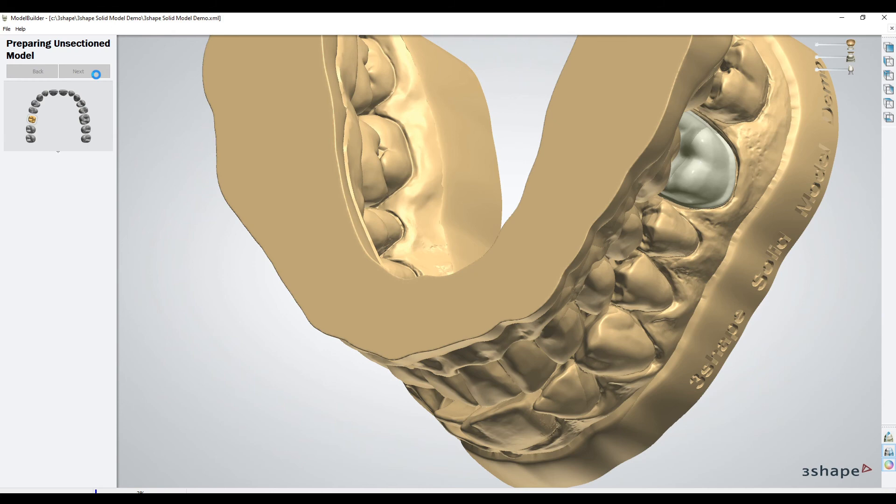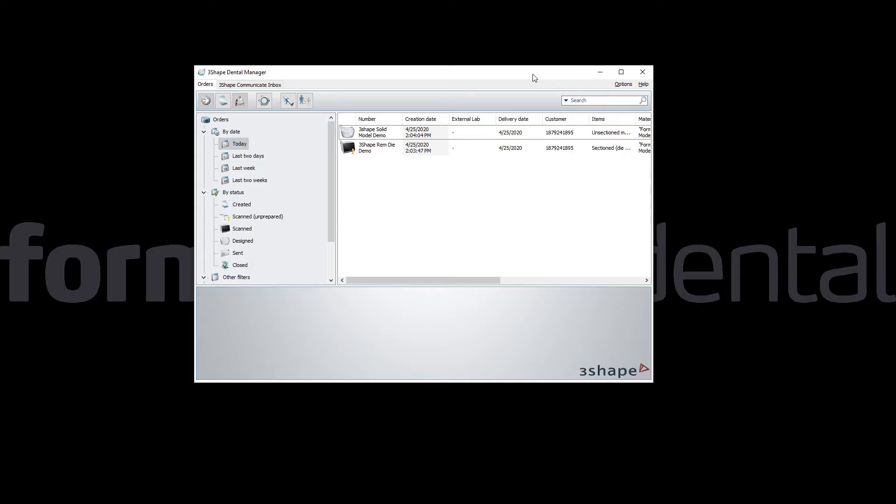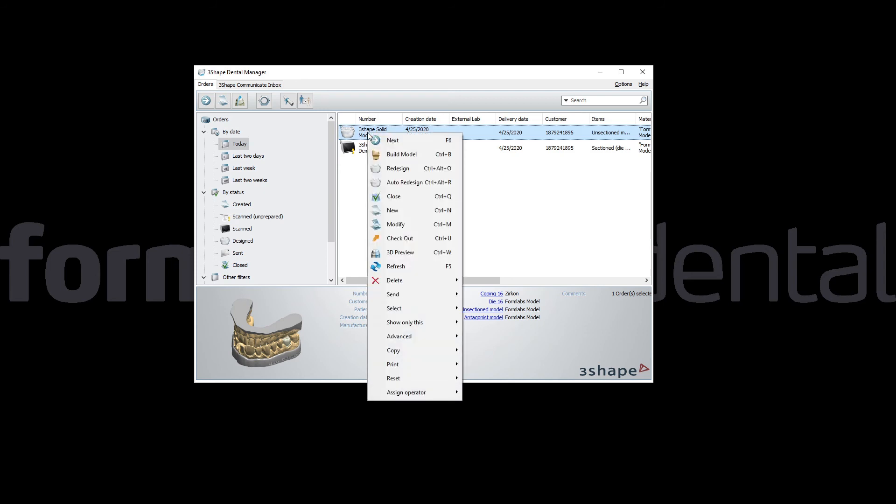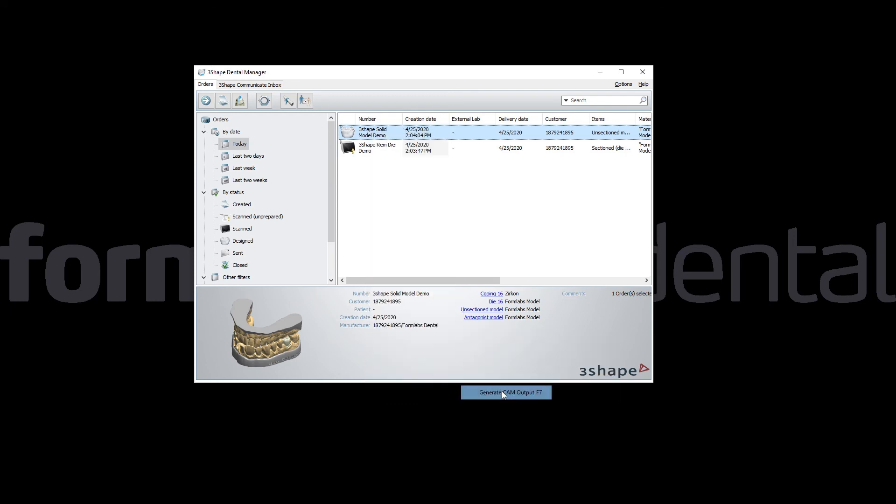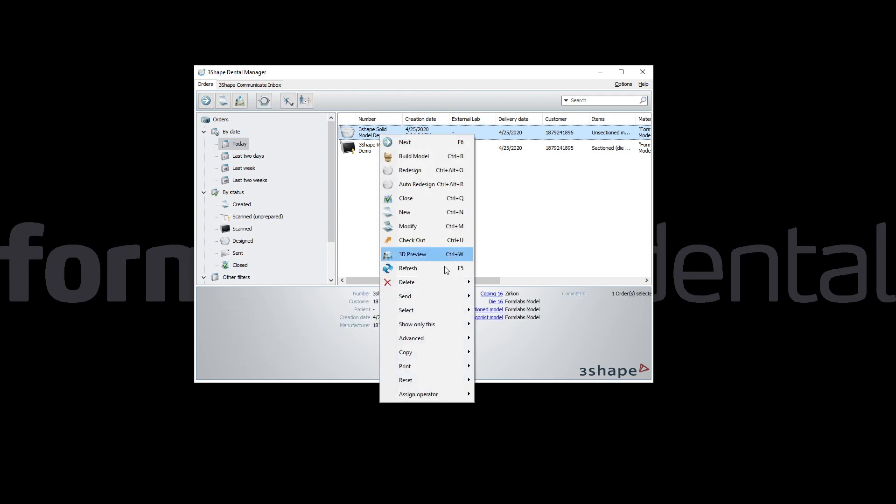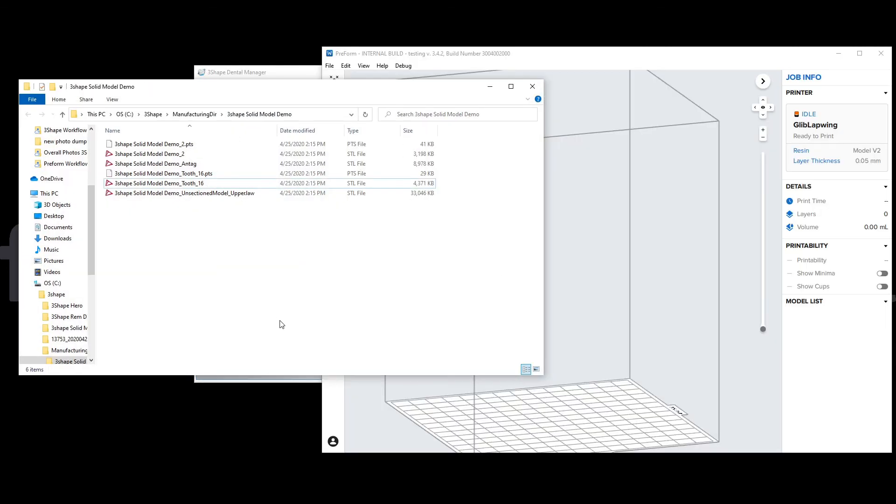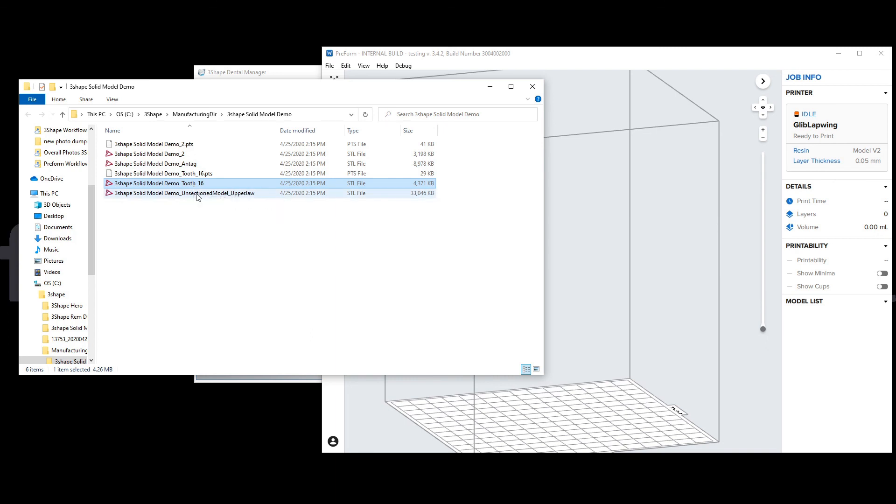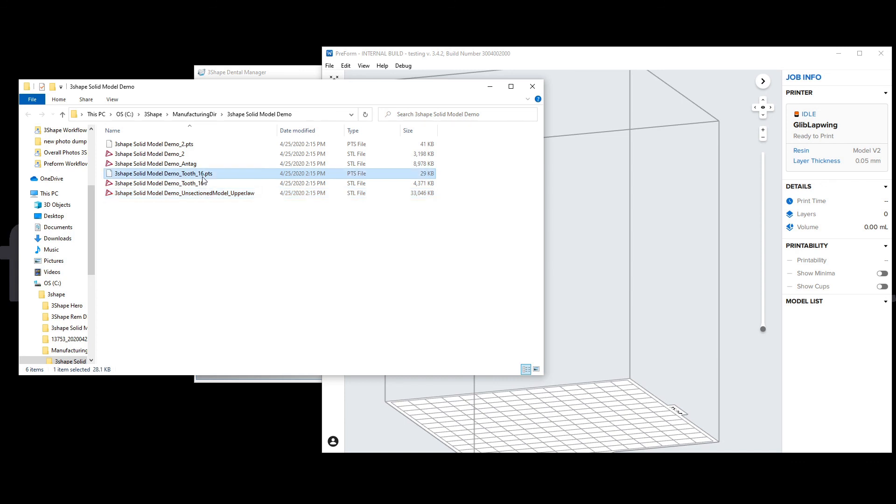Now the model builder is closed and it saved the files out. Here is our case. Just like you would generate a manufacturing file for a restoration and send it to your milling machine, printer, or milling center, the same procedure goes here. You go to Advanced, Generate CAM Output, or F7. Once it thinks about that for a little bit, you right click again, Advanced, Explore CAM. Now I've explored to the manufacturing folder for 3shape. You can see here we have a couple files. The first one, the two, is actually our coping or restoration. The one labeled ANTAG is the antagonist or the opposing arch. Tooth 16 is actually the die or the working die for a solid model. The unsectioned model is our operative arch solid model. You can notice here that there are .pts files—you can ignore those.